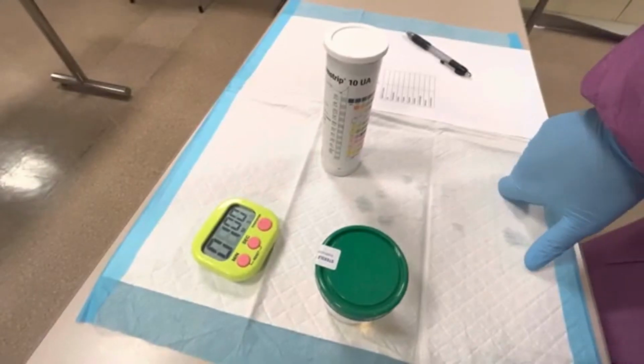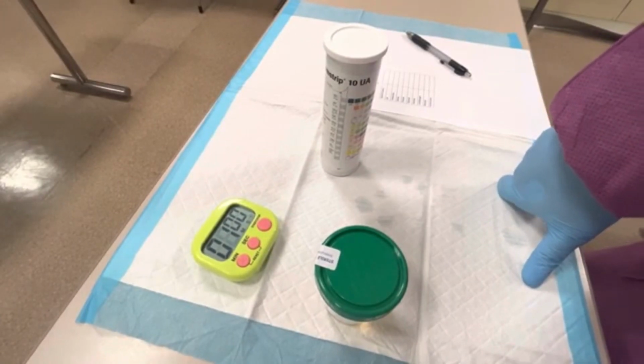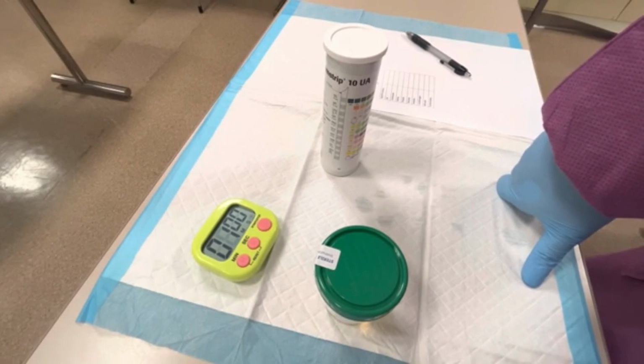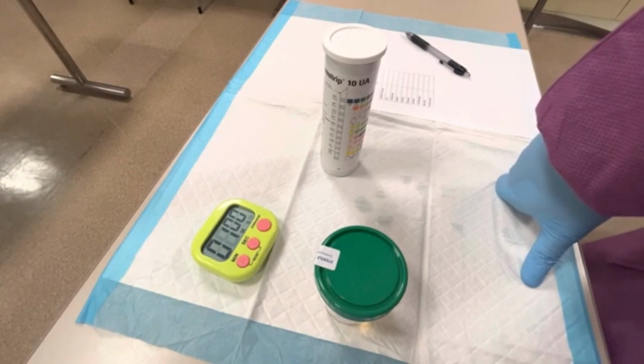Okay, so in this video, I'm going to be showing you how to perform a manual urine dipstick test on, of course, a urine sample. So a urine dipstick consists of a series of pads that are embedded on a reagent strip that provide a semi-quantitative assessment of various potential contents of urine.